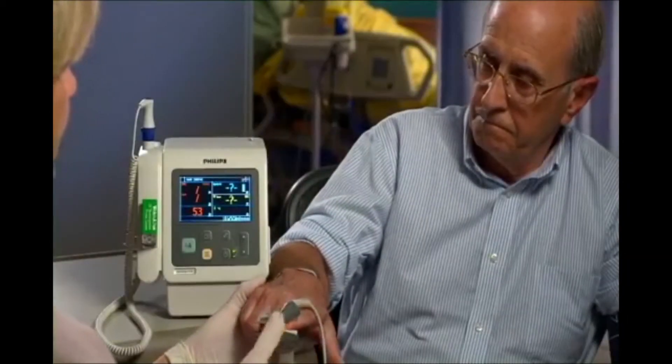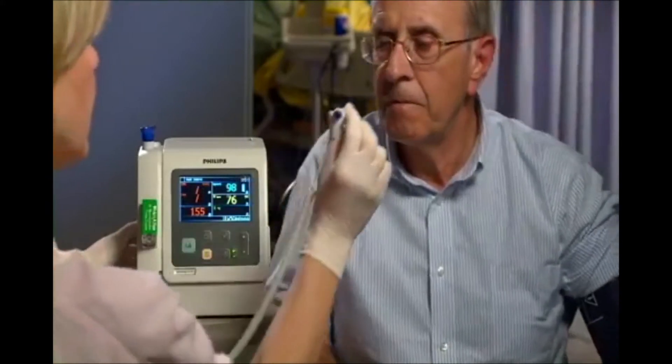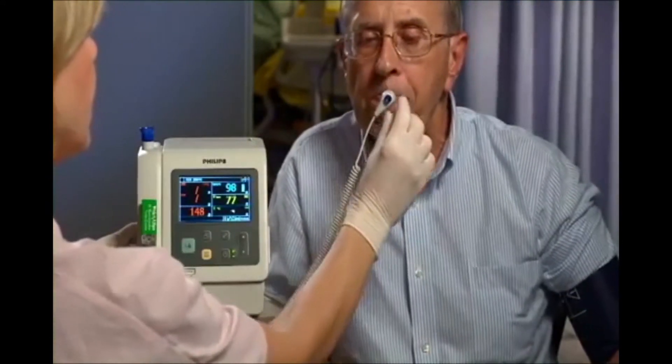The Philips SureSigns VSI monitor provides accurate automated vital signs in seconds in a variety of clinical settings, including hospital and outpatient settings.